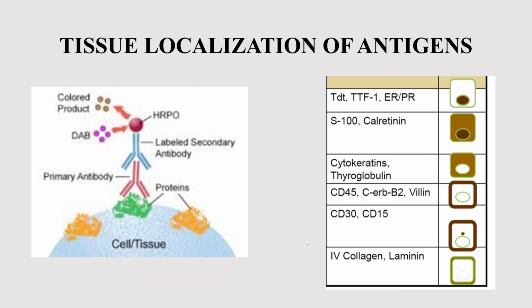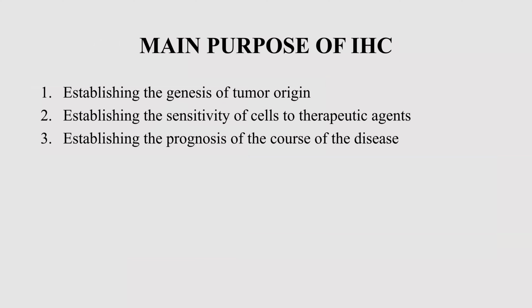With immunohistochemistry we establish tumor origin when we find some solid structure with no idea what it is, and we stain for fibrillar and membrane structures, typical epithelial antigens or blood cell antigens, and we can establish the origin of the tumor and find the primary tumor in organs.